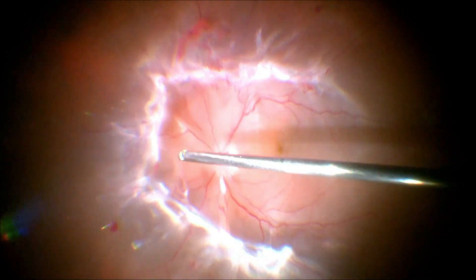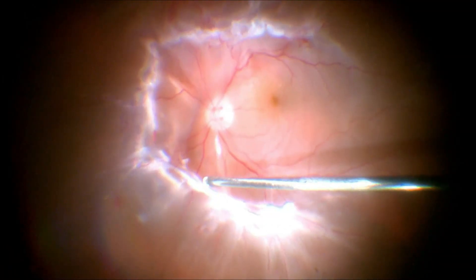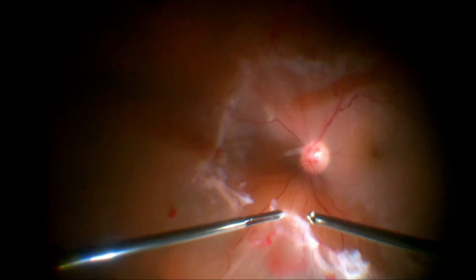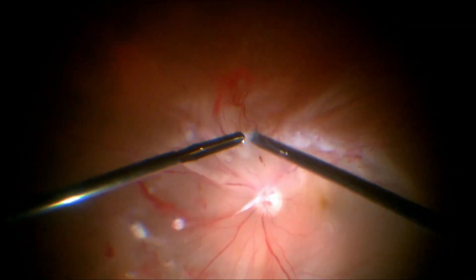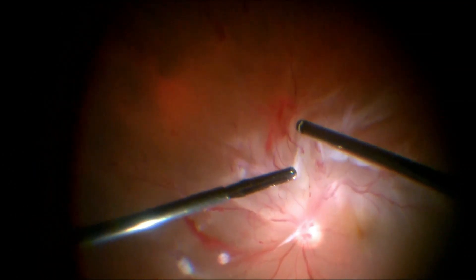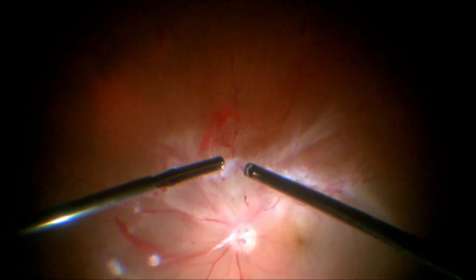We start the dissection with the cutter but eventually shift to bimanual surgery using the chandelier light. This allows us to use a forceps in one hand and a cutter in the other, giving us finer control and safety to carry out the dissection.